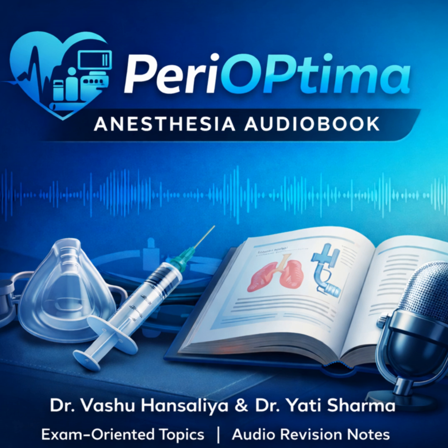So you need a mode that guarantees ventilation? You need a mode that guarantees minute ventilation. So you'd use something like CMV or volume AC. This is not a patient you want on a spontaneous mode where their ventilation could be erratic.